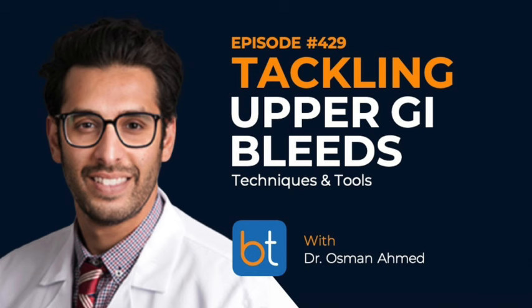Yeah. I think with respect to contraindications, just general contraindications to angiography apply, such as renal function, coagulopathy, things like that. But the reality is if the patient is unstable enough, the benefits of embolization typically will outweigh those risks, but otherwise minimal contraindications that I'm familiar with.